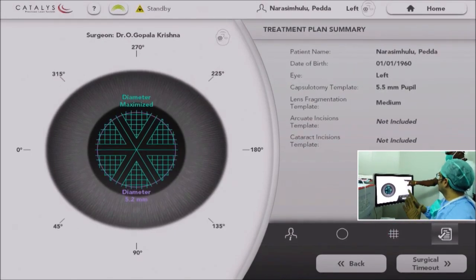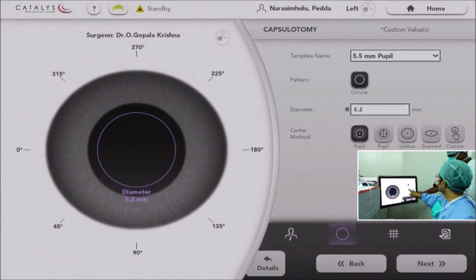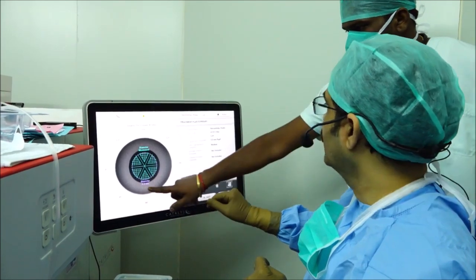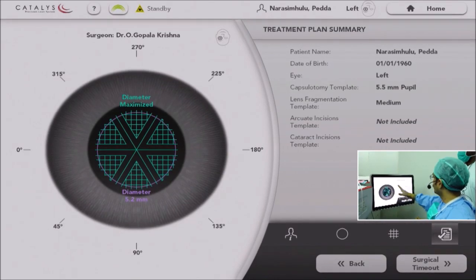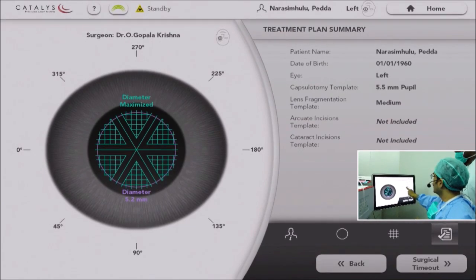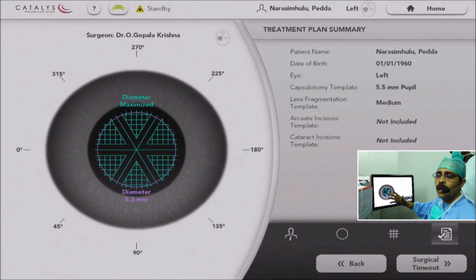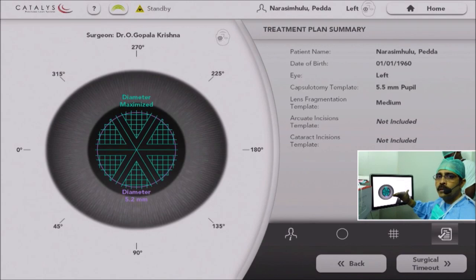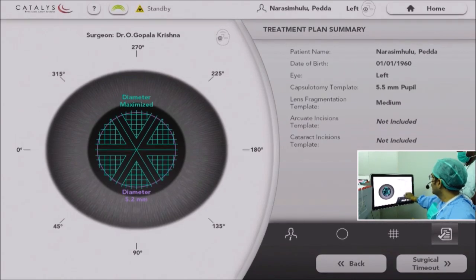The treatment plan summary is shown on the screen. In this case I am using 5.2 mm. The capsulotomy template is pupil centric. The fragmentation template is for medium hard cataract. Another advantage is you can correct corneal astigmatism with the help of this femto laser up to about 1.5 diopters of astigmatism. It will not help much if the astigmatism is more than 2 diopters — in that case we have to go for a toric IOL. But for minimal astigmatism of 1, 1.25, 1.5 diopters, you can correct it with arcuate incisions. In this case the cornea is spherical, so I did not use the arcuate incision template.